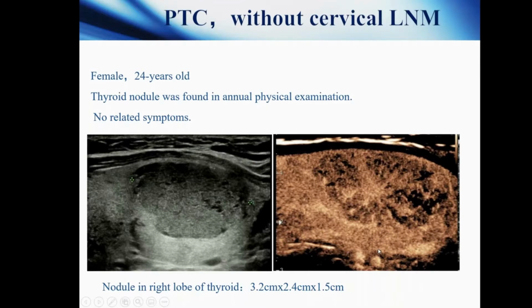The appearance is similar to some adenoma, maybe it's benign.